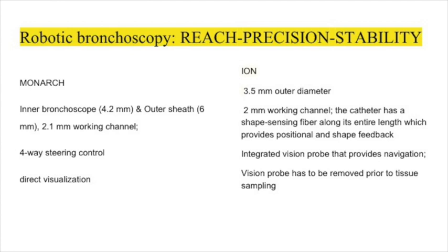One thing worth noting is that if you plan to combine cone beam CT scan with electromagnetic navigational bronchoscopy, you have to be mindful about the distance between the field generator and the metal part of the CT cone beam.